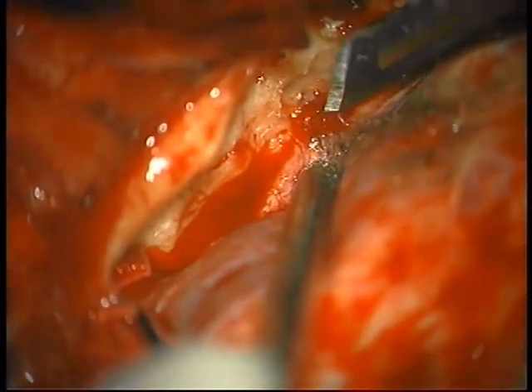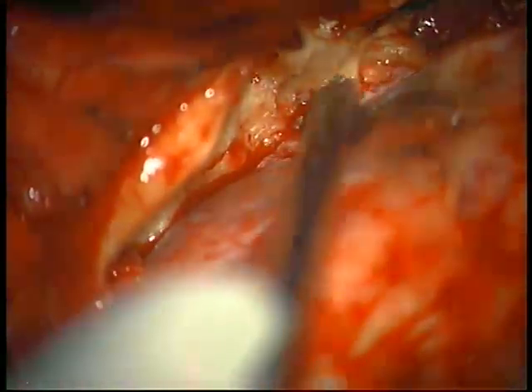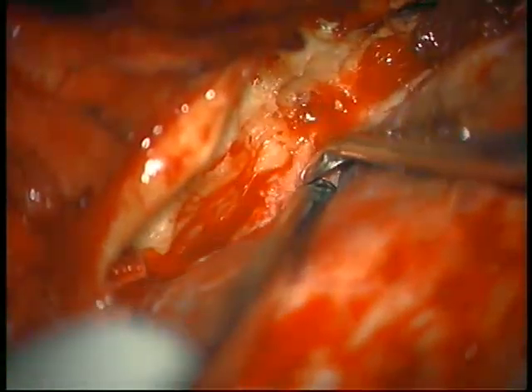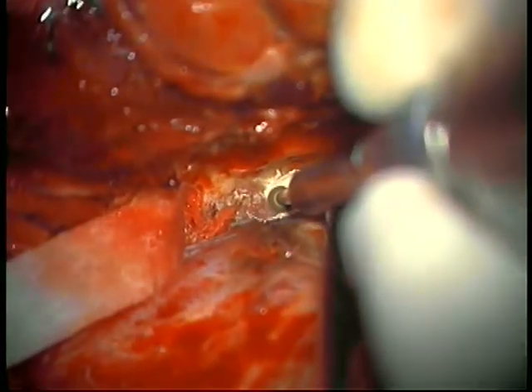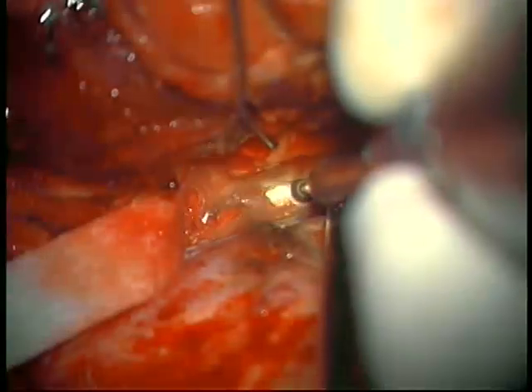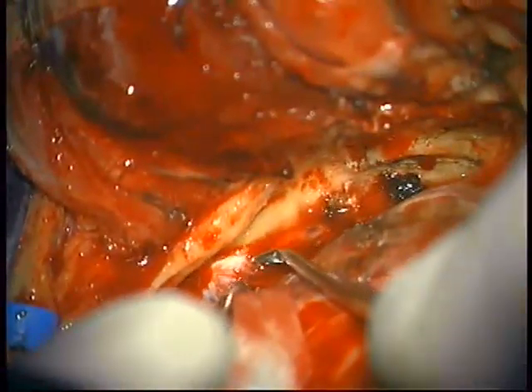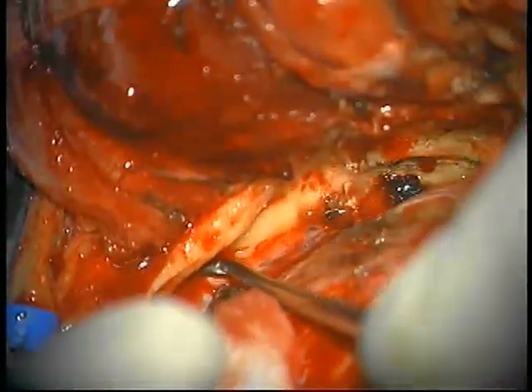The middle meningeal artery is cut to get more space in the middle fossa. Anterior and medial to the foramen spinosum is the foramen ovale, which is also expanded to get more space behind the V3 branch of the trigeminal nerve. The dura is separated from the middle fossa to locate the arcuate eminence and the greater petrosal nerve.